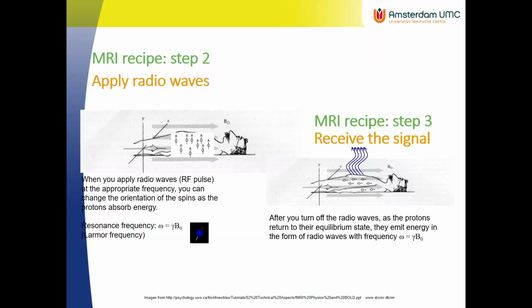You have a question? Yeah. So the question is if it's only the one proton that's aligned with the field that produces a signal and absorbs the energy.